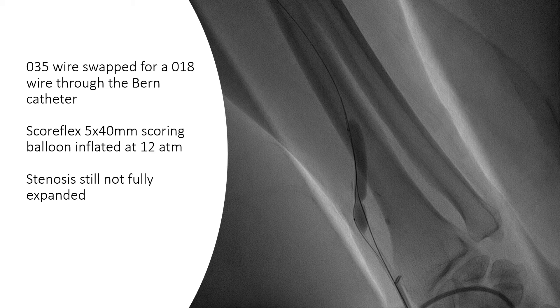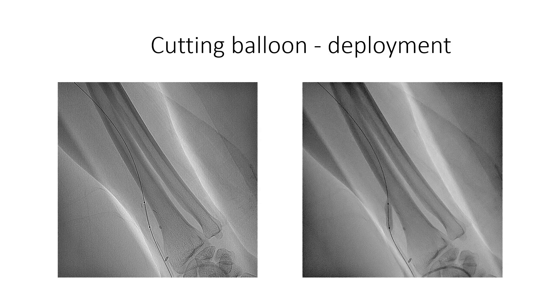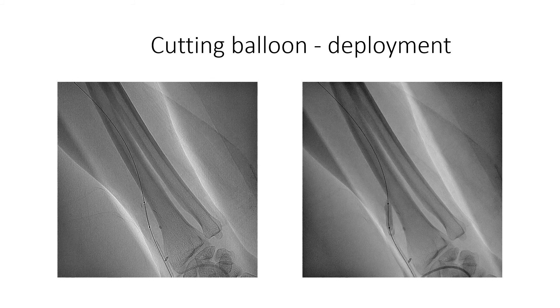It still couldn't crack the lesion. We attempted a cutting balloon — the peripheral cutting balloon from Boston Scientific. There was initial waisting but subsequently it cracked the lesion. We confirmed the position of the balloon using contrast injections. The picture here shows an injection to confirm that the balloon is placed within the vein, and again with the balloon fully inflated we did a small test to make sure that the artery is filling well and the inflated balloon remains within the vein.